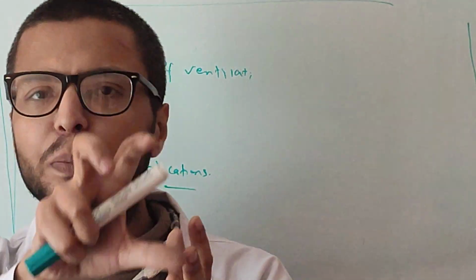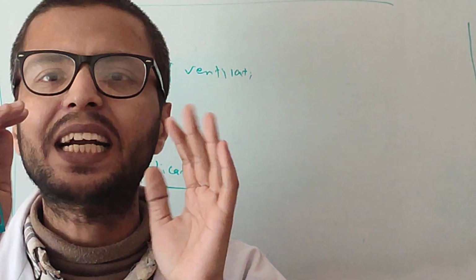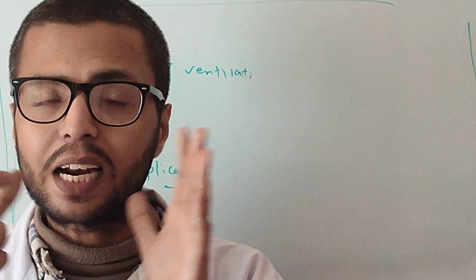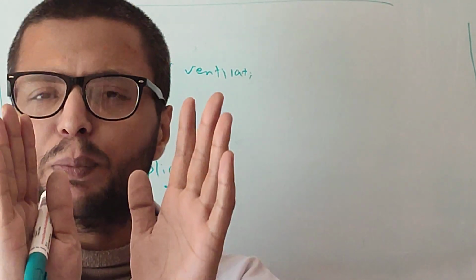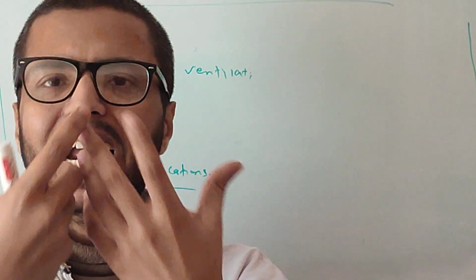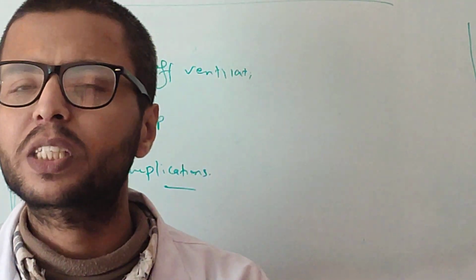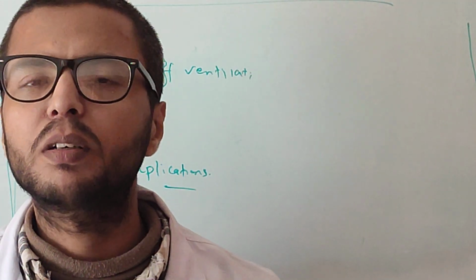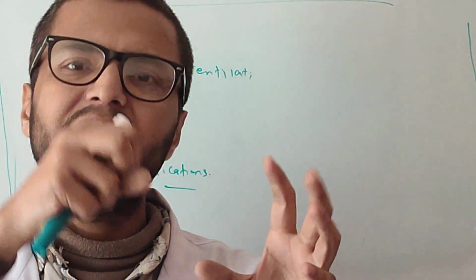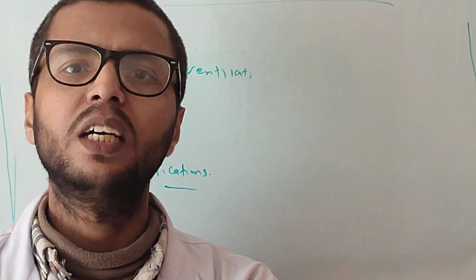And you are giving positive pressure. That positive pressure is not only going inside the trachea, but also going inside the stomach. That is called aerophagia. So abdominal distension, abdominal discomfort, and bloating can occur due to aerophagia. And since you are giving positive pressure, you are restricting the cardiac filling because of the increased intrathoracic pressure. That's why cardiac output falls. If the patient already has low BP from the get-go and you are keeping them on vasopressor medications, you are making the pressure come down further because of the increased intrathoracic pressure. So also be watchful for BP in patients started on NIV.